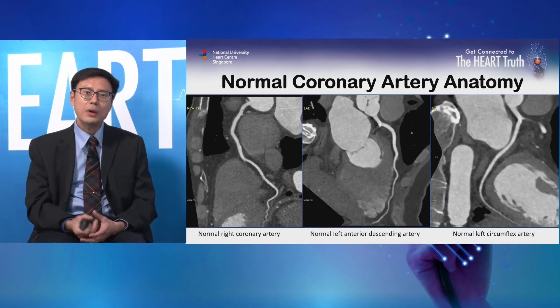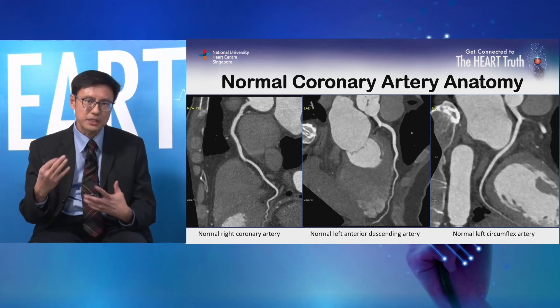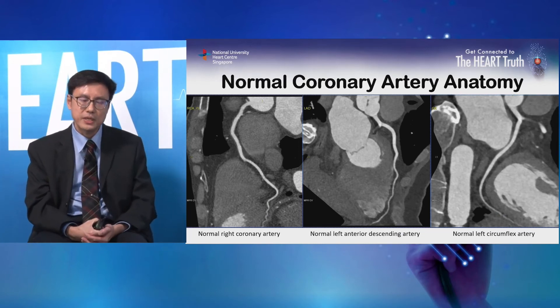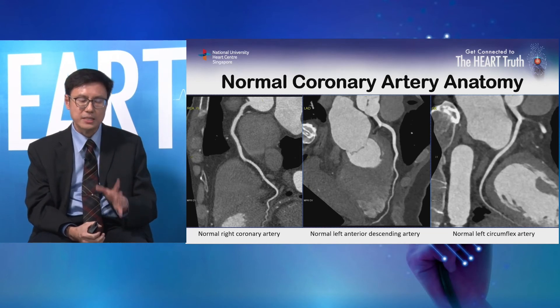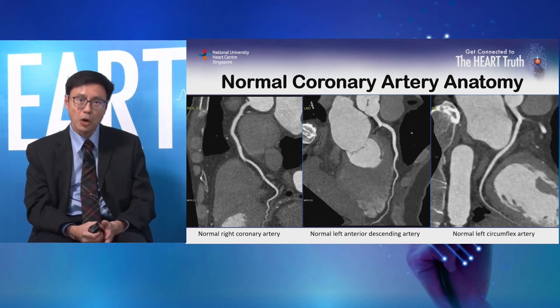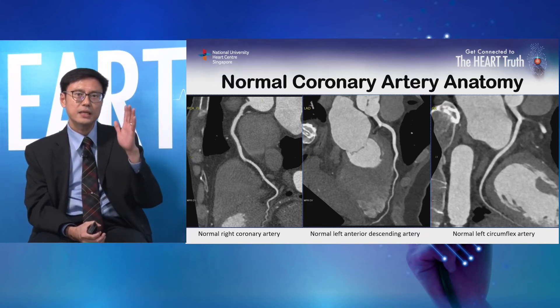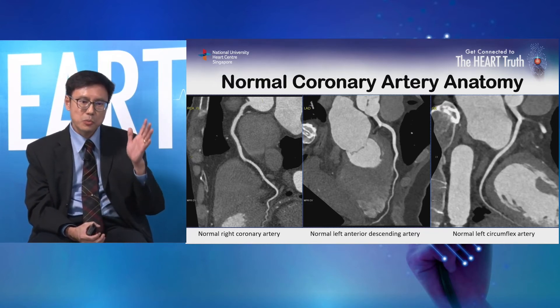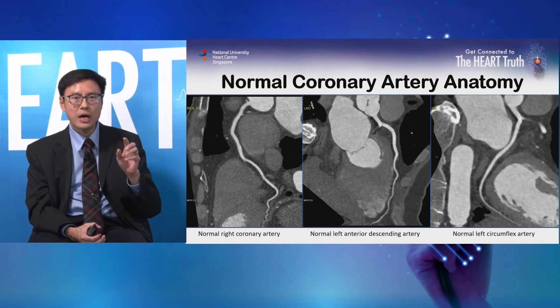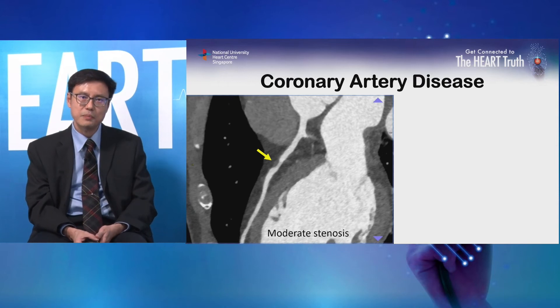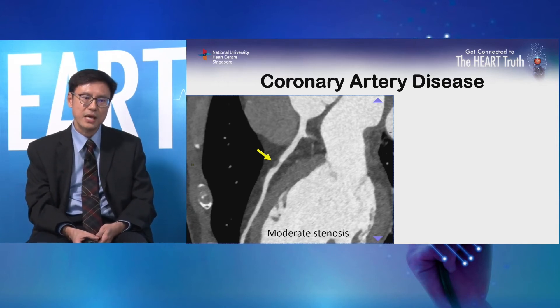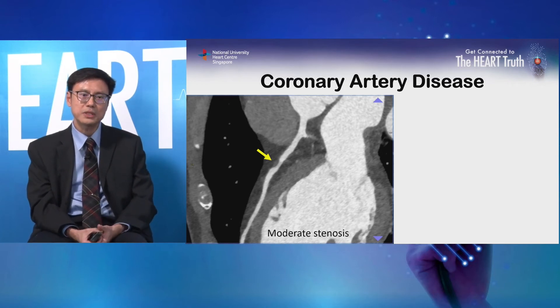When the dye is injected and contrast enters the coronary arteries, the lumen of the arteries shows up as white. These pictures are from a patient with normal coronary arteries — the artery wall is very smooth with no narrowing or obstruction. As opposed to this particular patient, where you can see a little narrowing in the middle of the artery — this is the left anterior descending artery, caused by an atherosclerotic plaque.